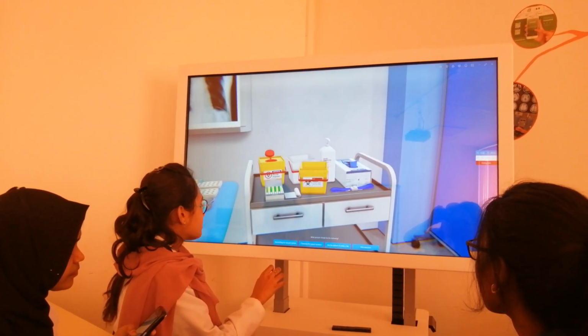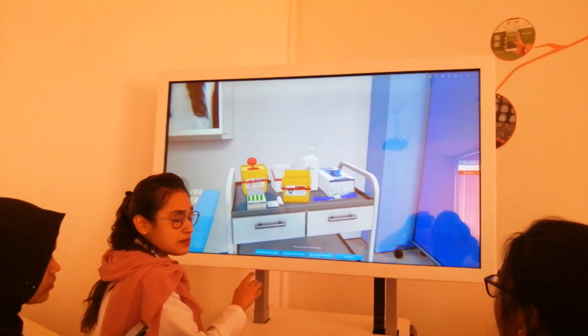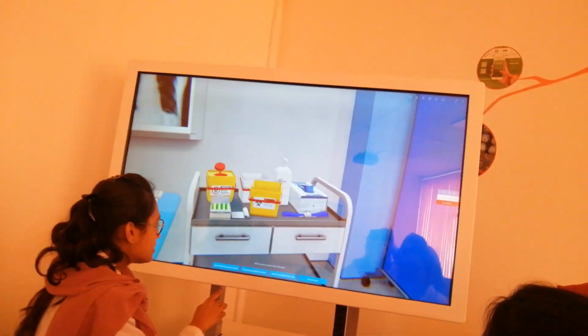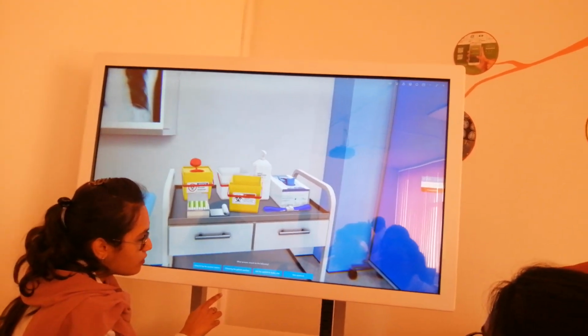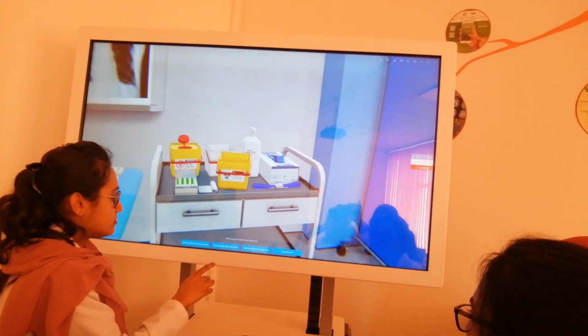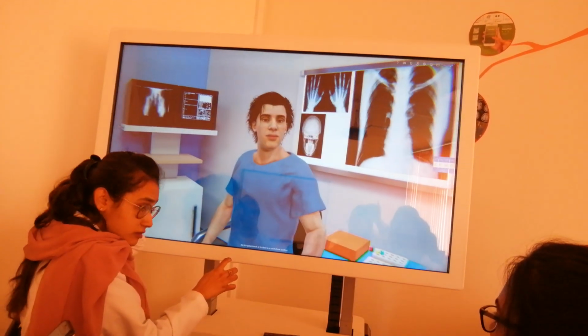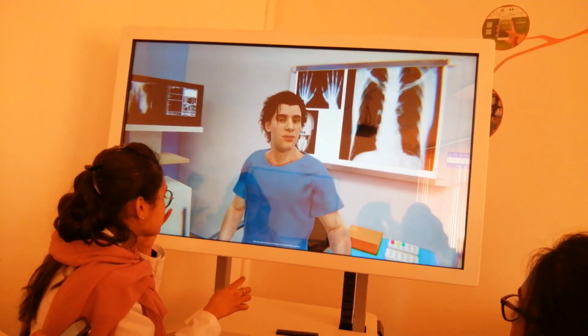What process should be the following? Assembling the vacuum system. Assembling the vacuum system. Choosing the patient position. Ask the patient to make a fist. Vein puncture. Choosing the patient position. Ask the patient to sit or lie down in a comfortable position.